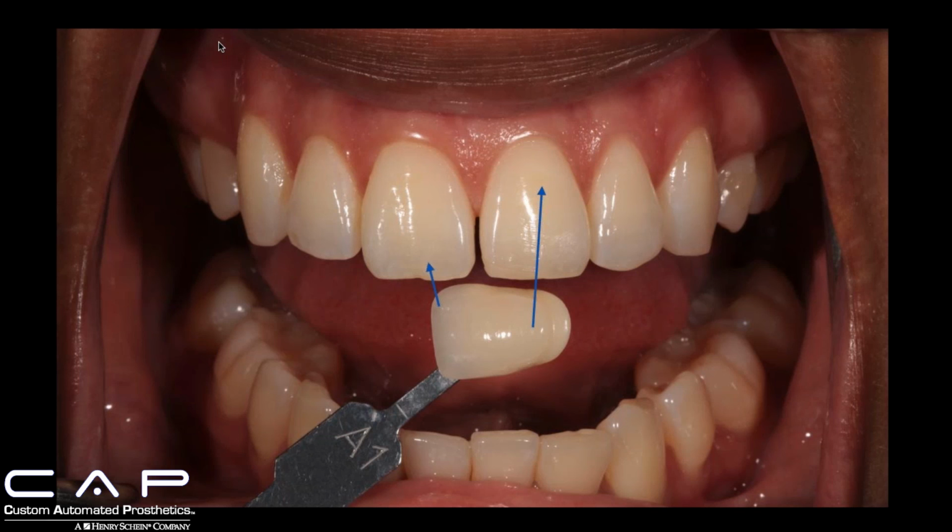A lot of technicians have a code, or they'll etch or cut little grooves into each shade tab, and the pattern of those grooves tells them what shade it is. That way they can get closer with their camera. But I'm not going to go through and cut up my shade tabs at this point.